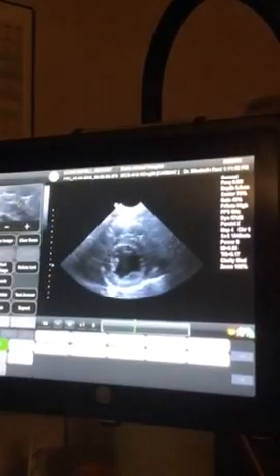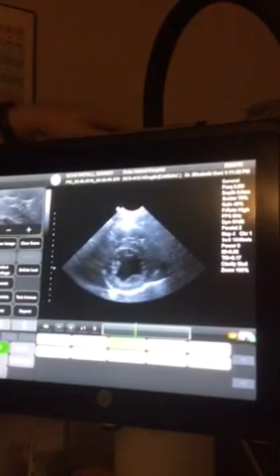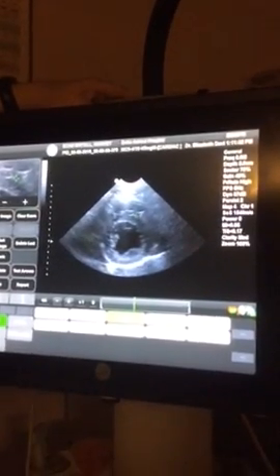It just jumps. It will jump. That's not the case on the 2 circles. That's correct. That's also correct. It gets very confusing. Yes, that's correct. Okay.